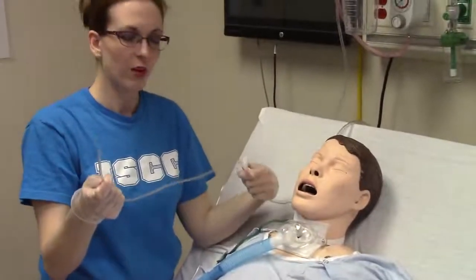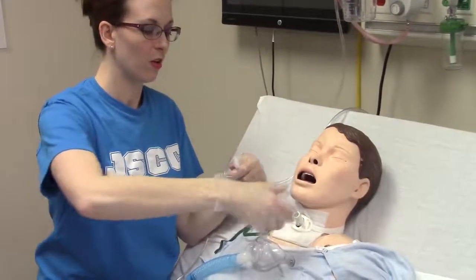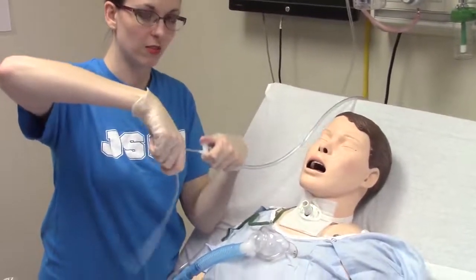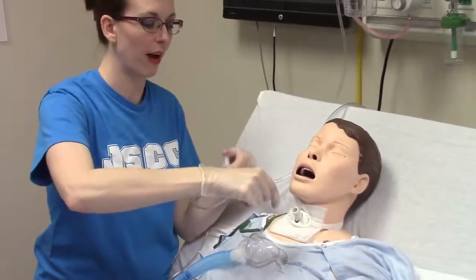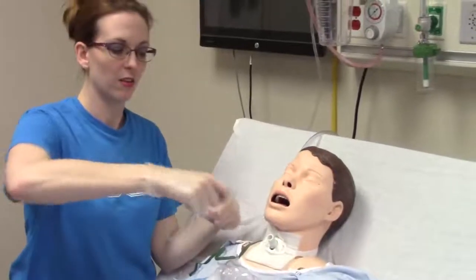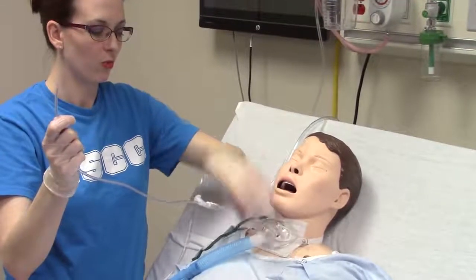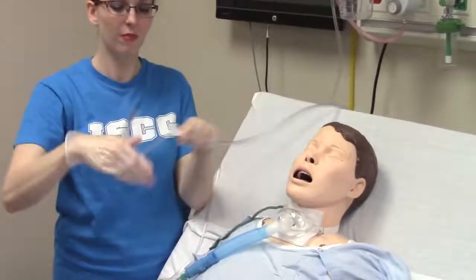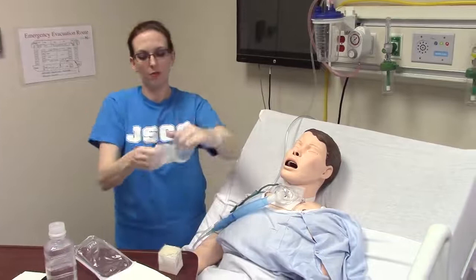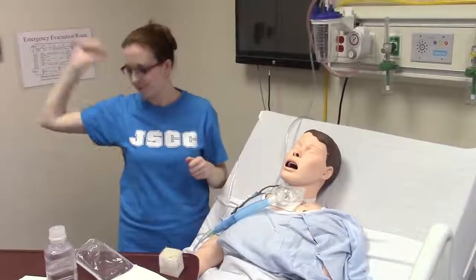Make sure while you're pulling out that you maintain control of the catheter. The wrong way is to just pull it out carelessly — look what happens: you've broken sterile technique. So as you come out of the trach, make sure you are coming back and maintaining control of the catheter at all times. When done, give the patient their oxygen back. This catheter is contaminated and dirty, so put it all together in your gloves to throw away.